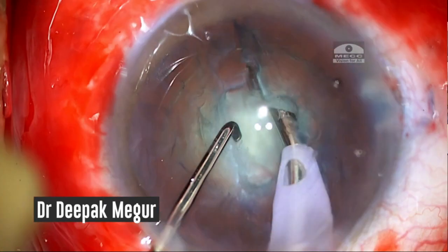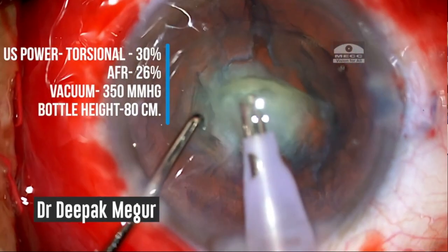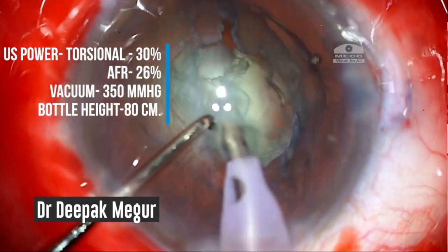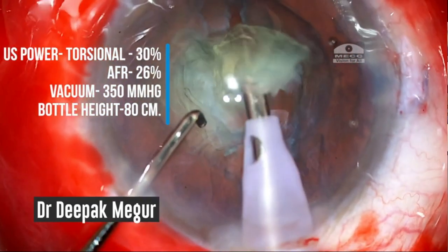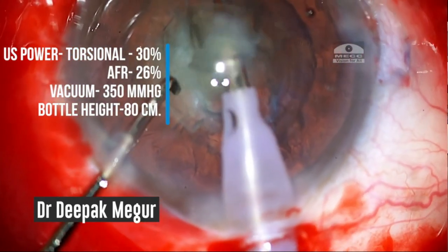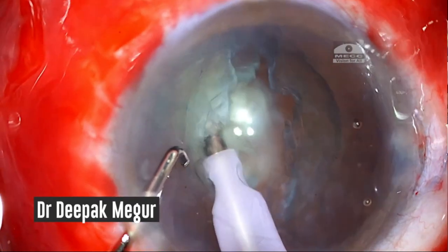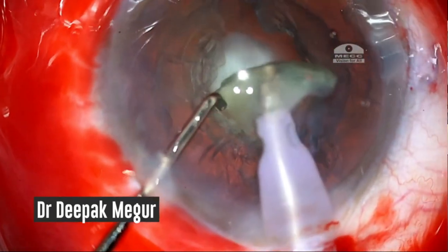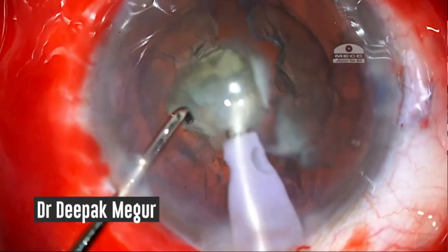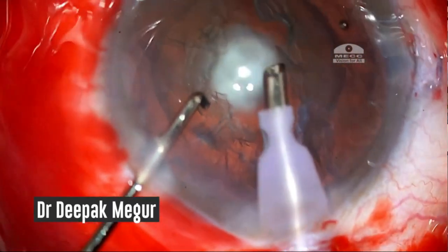And without any rotation of any of the fragments, each of these fragments is emulsified using the slow motion technique, as has been described by Dr. Osher, using low parameters, low bottle height, and a low bar. The emulsification of the nucleus is not at all an issue here, because it's extremely soft, and each of the two heminuclei pieces is emulsified.